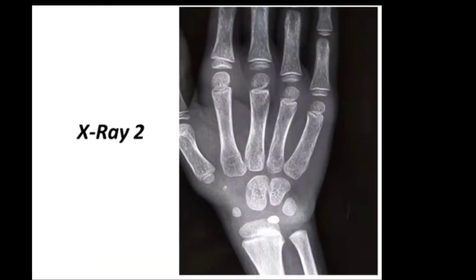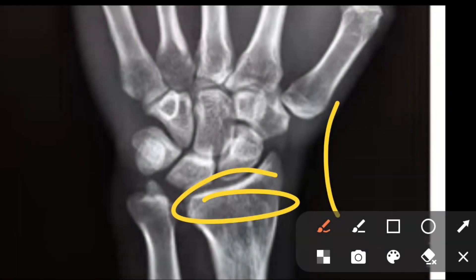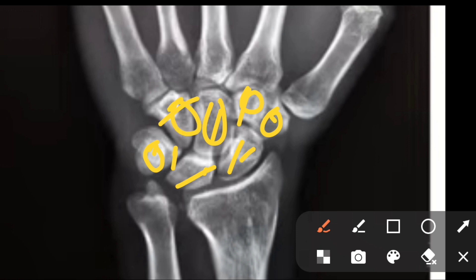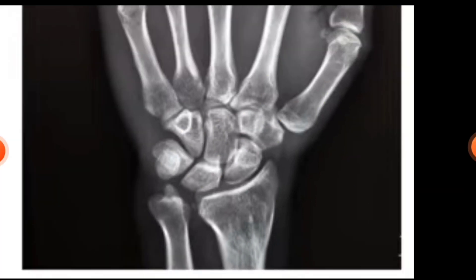Now for x-ray three: the radius head is fused and the ulna head is also fused. Radius lower end appears at two years and fuses at 17 to 18 years; ulna head appears at five years and fuses at 17 to 18 years. Count the carpal bones: one, two, three, four, five, six, seven, eight — all eight carpal bones are present, including pisiform, which appears last at 11 to 12 years. So age is greater than 12 years.